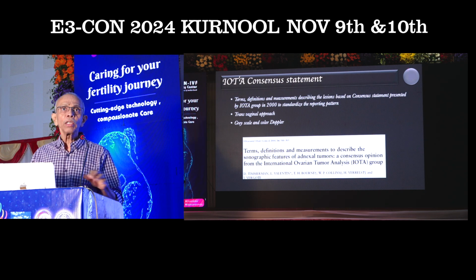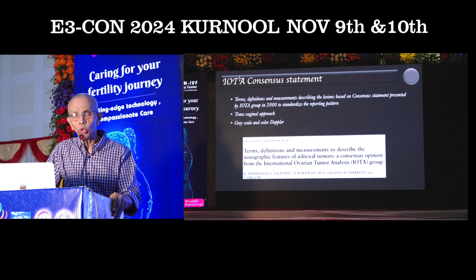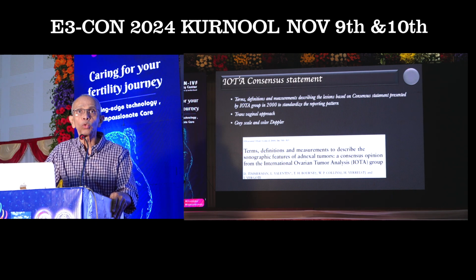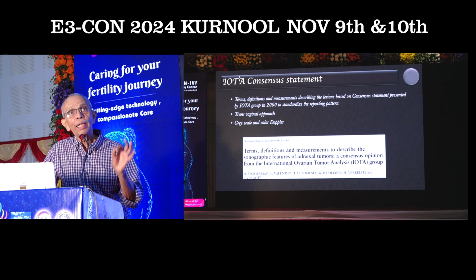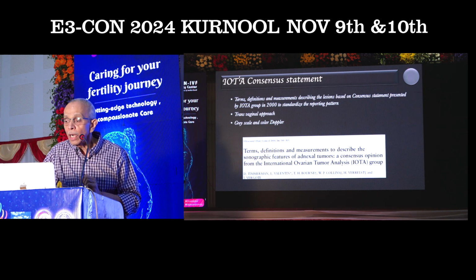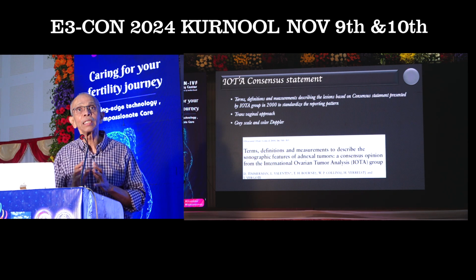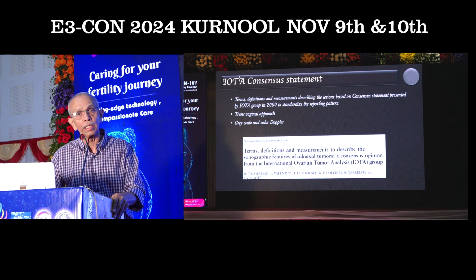Now, the IOTA group, as I said, is the International Ovarian Tumor Analysis Group. They have published a consensus statement in the year 2000, wherein they have defined certain terms, and they have also indicated the way we are going to measure these adnexal lesions. Not only that, based on this, they have come forward with a categorization of these adnexal lesions as benign and malignant lesions. That is one.